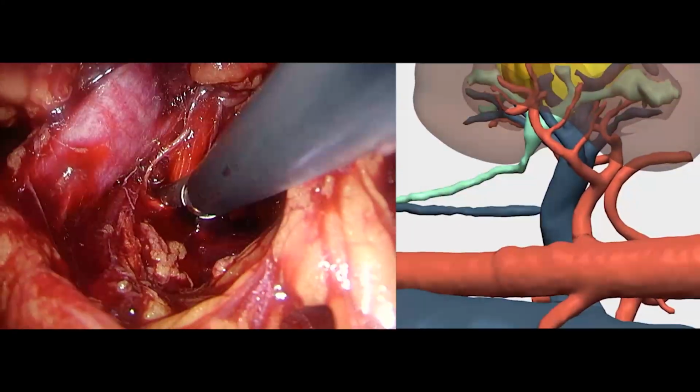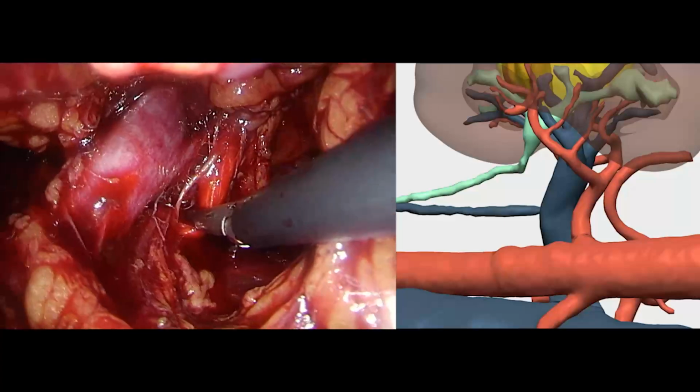The renal hilum was identified, and the renal artery was isolated for clamping.